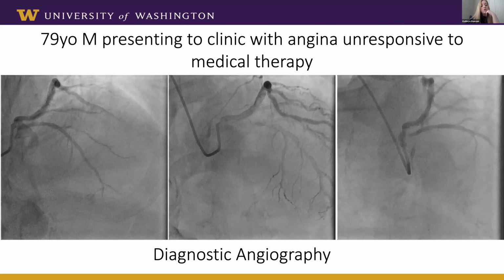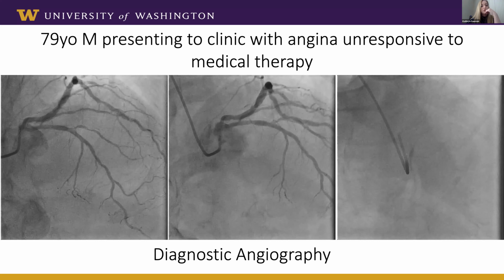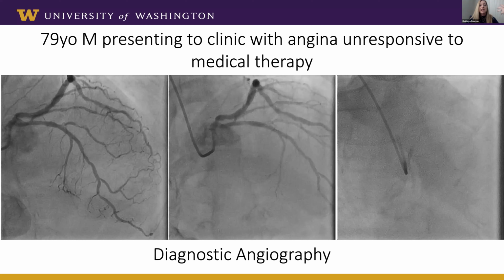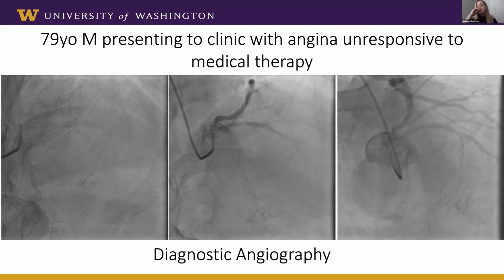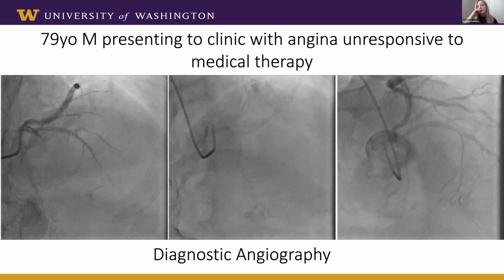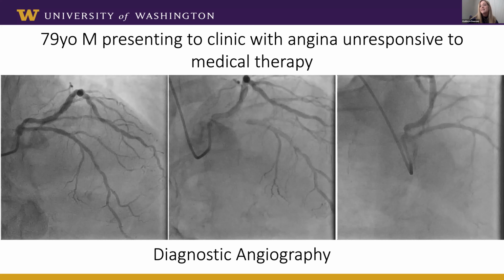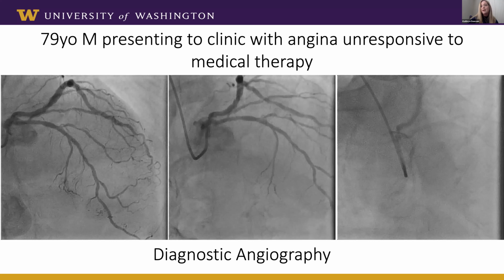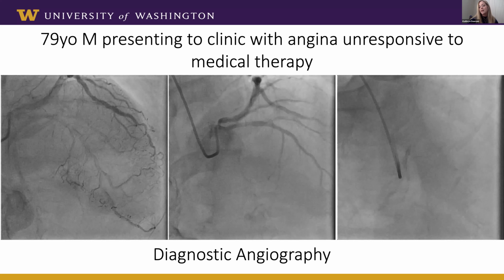You can see here that on his diagnostic imaging, it appeared that his left main was quite short, and as such, they had some challenges engaging the guide and getting pictures that didn't have a ton of blowback. But I think you can pretty well see here, particularly in the zoomed up image on the right, that he has a short left main and what appears to be calcified disease, which involves probably the ostium of the LAD and maybe the ostium of the circumflex. It was a little bit hard for us to tell when we got the referral exactly how much of each branch was involved, but it certainly seemed to involve the LAD.